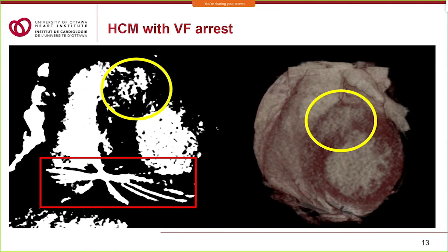And so just as we get problems in MRI with leads, we also get problems with CT. And the problem with this in particular is that you get artifact along the inferior wall of the ventricle. And of course, every case that Callum sends me has a right coronary artery infarct, and so there's always terrible artifact in that area. But that's what we have to deal with.